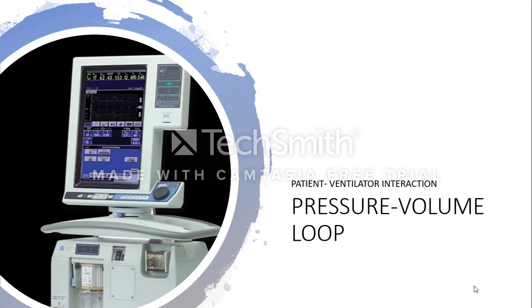Two types, loops and scalars. The ones that we've seen so far in the lab have been the scalars, and we'll learn more about them and their use at the bedside. But now we're going to learn a little bit about loops, in particular the pressure volume loop.